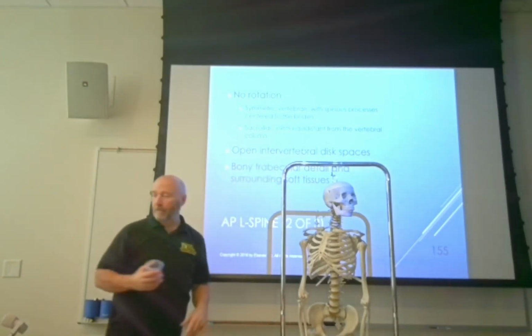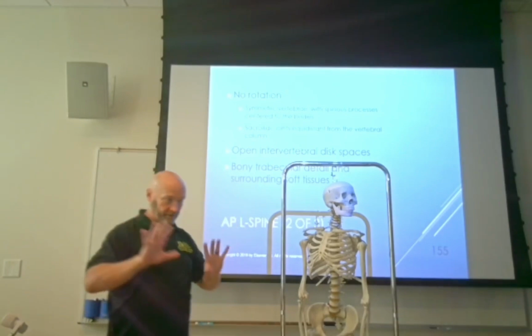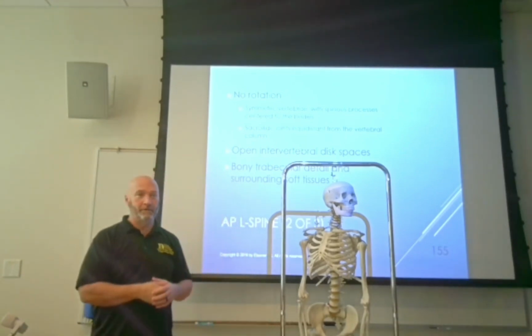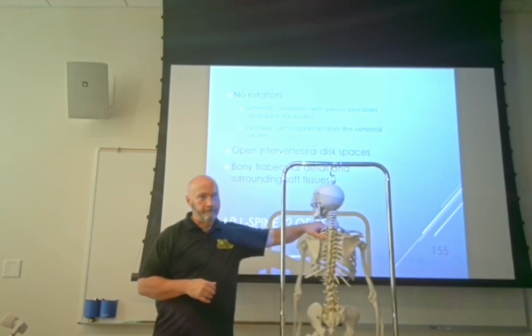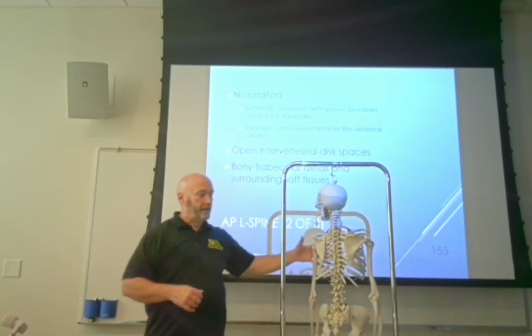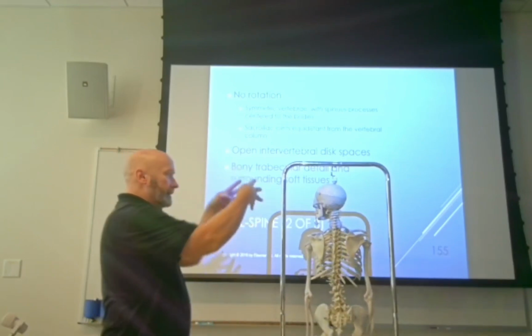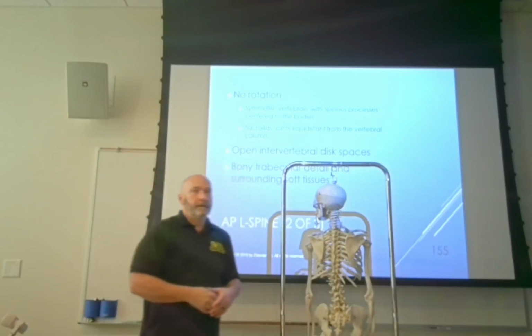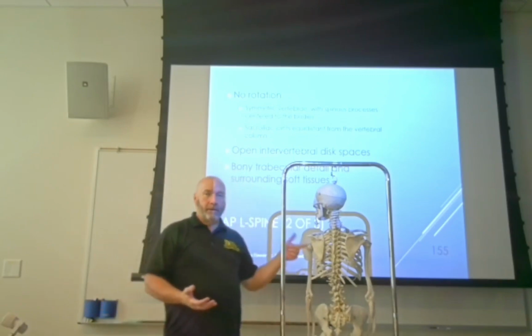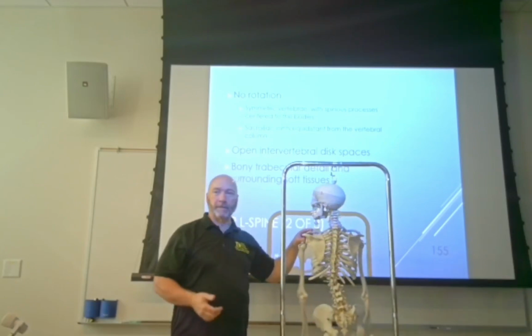Okay. So how could we get rid of some of that? How could we make it not like that? Just so you know, you're never going to do this, but how could you theoretically? All right. Now your disc spaces are going like that, and your central ray is going like that. Now they're parallel to each other, and you can see open disc spaces a whole lot better. So unlike the wrist, why do we not do this? Why do we not shoot our patient's PA?